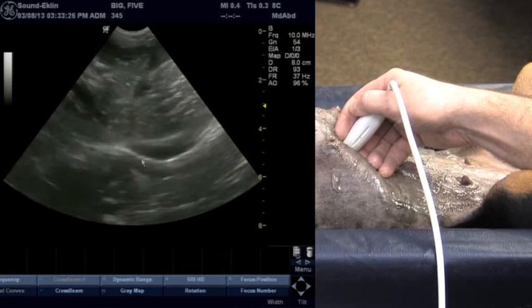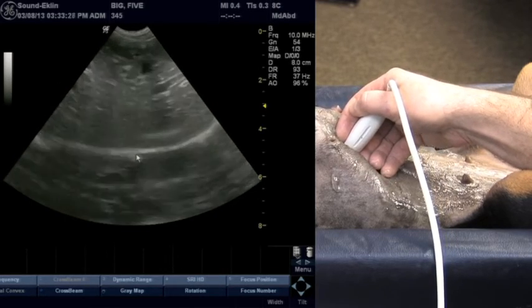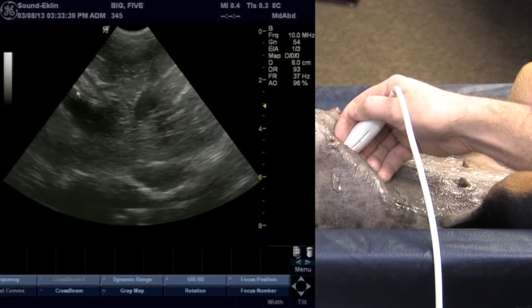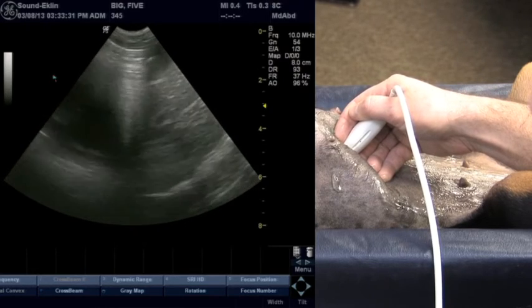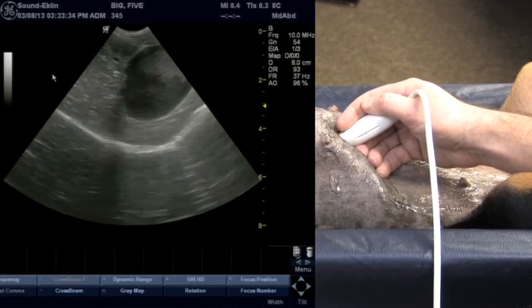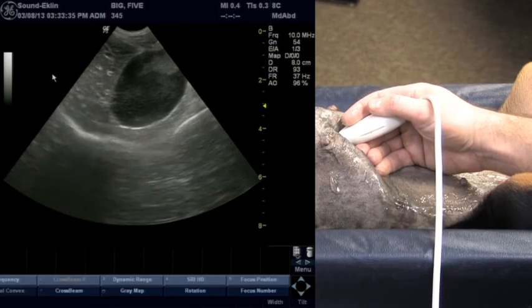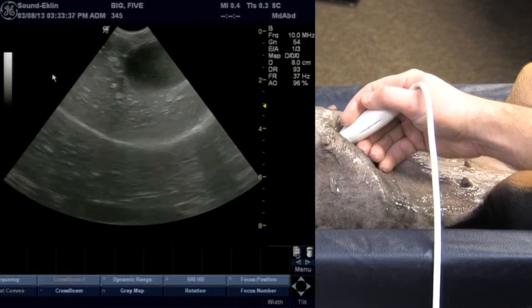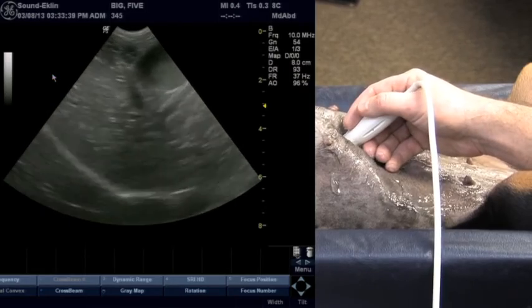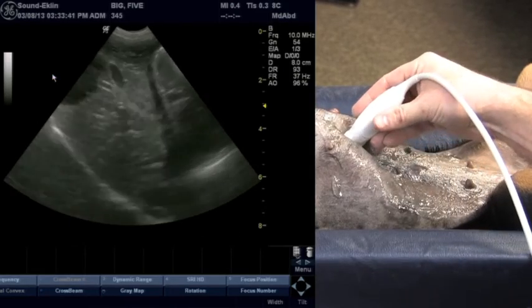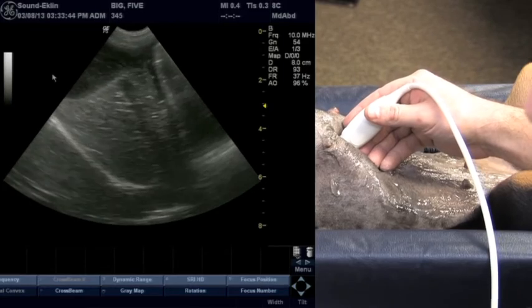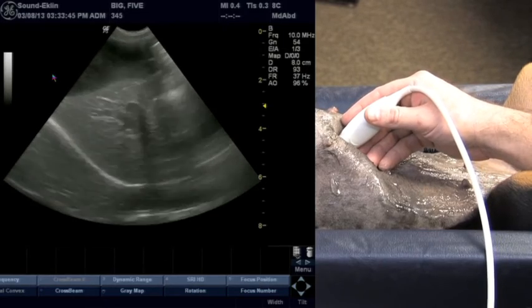This brings us into the area of the porta hepatis where we can see the hepatic vein and portal vein. We then sweep back up towards the ventral surface of the liver in a fanning motion. At this point, I rotate the probe back to a sagittal plane and we're right back to midline looking at the liver.